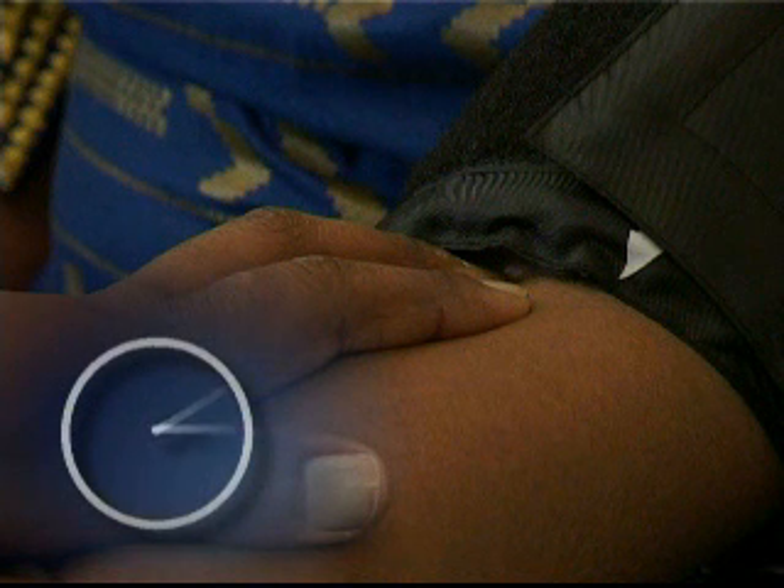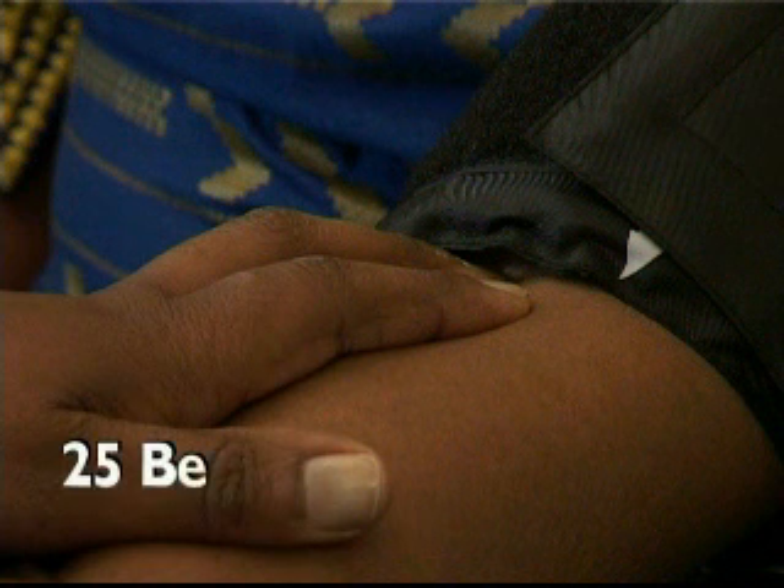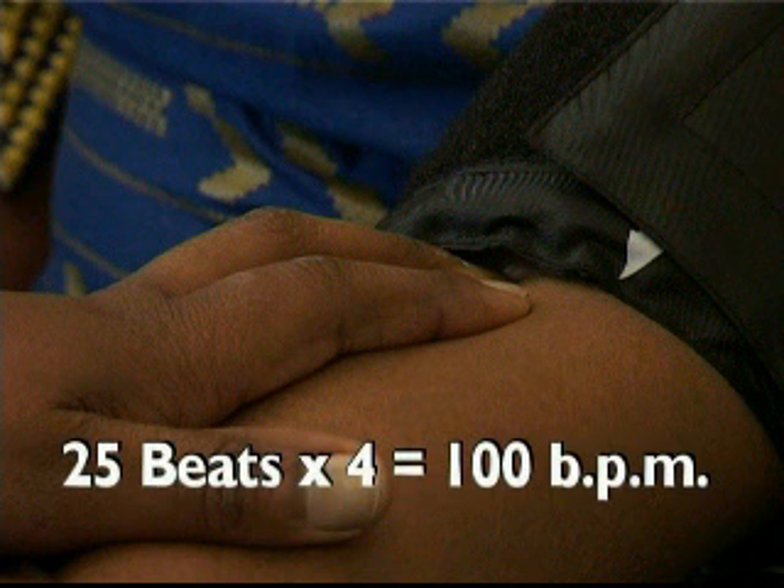Whilst performing this palpatory estimation, this may be an appropriate time to establish the patient's pulse rate by counting the pulse beats for 15 seconds at the brachial artery point and then multiplying the number by 4, resulting in beats per minute. For example, 25 beats in 15 seconds equals 100 beats per minute.